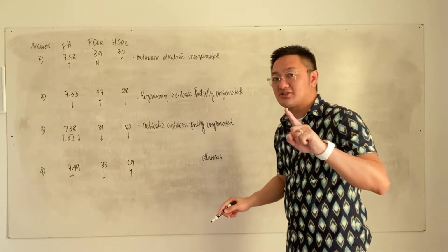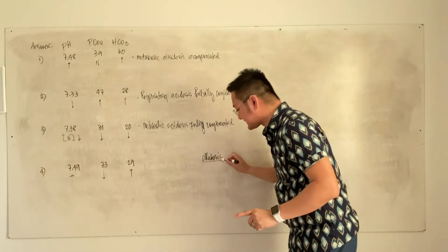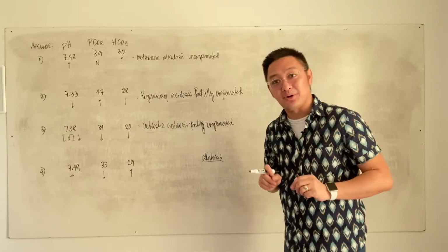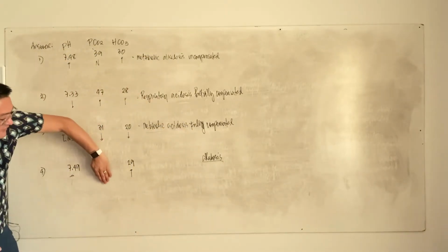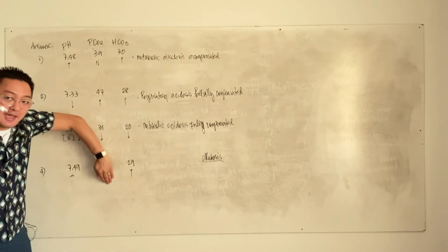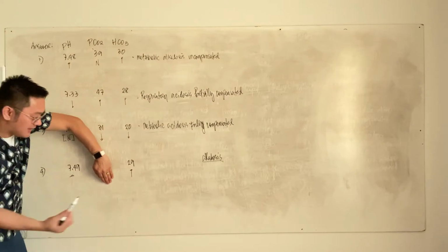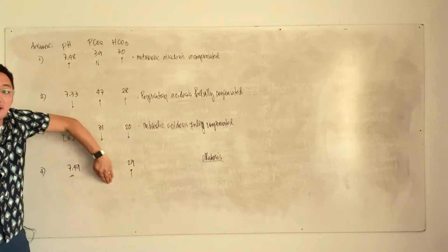Remember the steps in your ABG reading? The first step is to check the pH, and we were able to identify that the pH is alkalosis. Now, let's identify if this is respiratory or metabolic in nature. Let's try to cover your PCO2. If you cover PCO2, you check the bicarbonate and the pH, you suspect metabolic. If it is metabolic, these two must be equal. Are they equal? Yes, they're equal. Therefore, it is metabolic alkalosis.